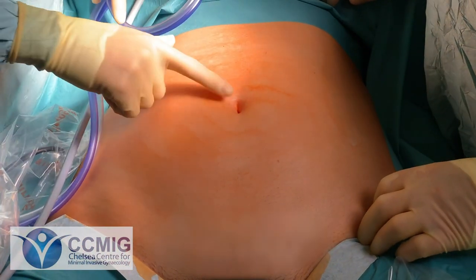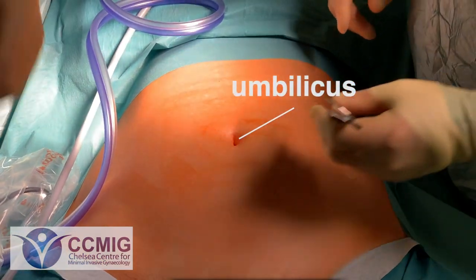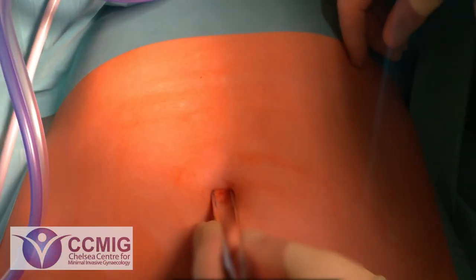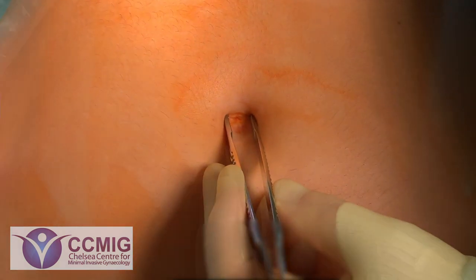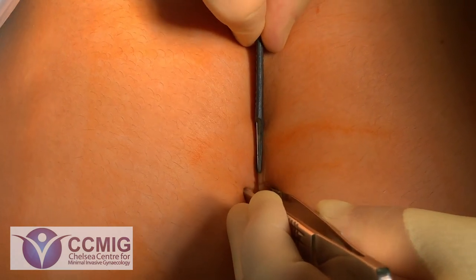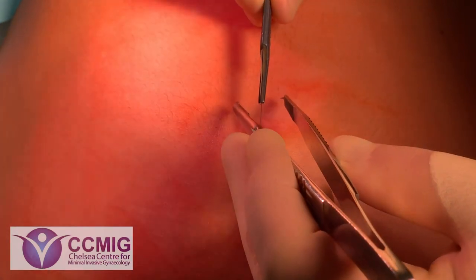So here we are about to perform our laparoscopy. We're going to do a three-port laparoscopy here, so that's three incisions on the tummy. The first and the main incision is on the tummy button, or as we call it the umbilicus. It's around about a 10 millimetre incision, so just about a centimetre. We use the umbilicus for two primary reasons: number one, it's central in the tummy and has a really good view looking down onto the pelvis; number two, it's a scar where all the layers of the abdomen are fused together and it's something that everyone already has.